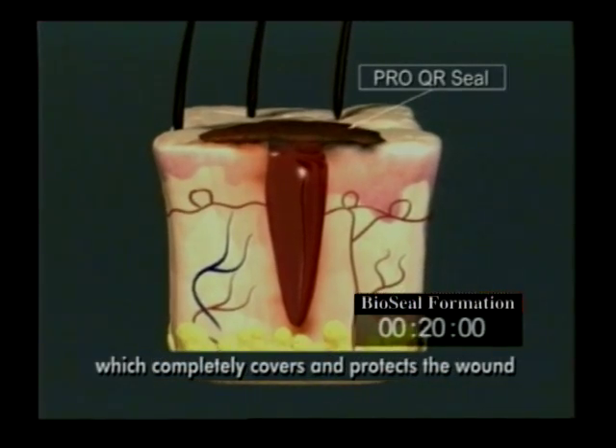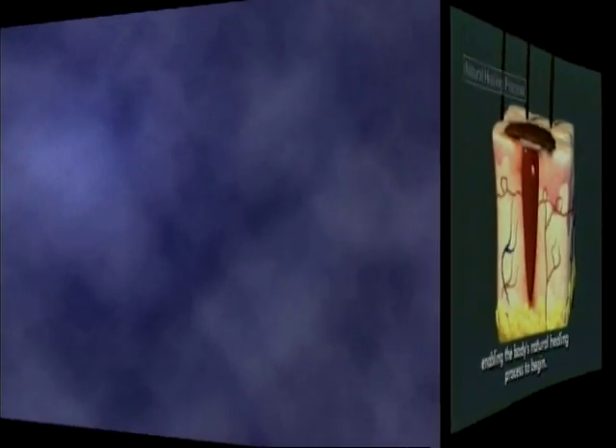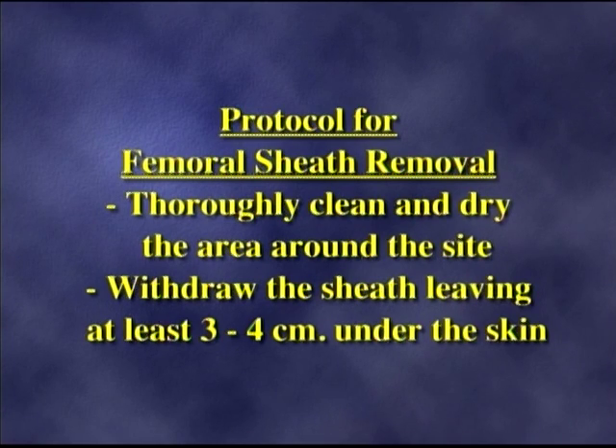Now let's take a look at how to use BioSeal Advanced. Thoroughly clean and dry the area around the site. Withdraw the sheath, leaving at least three to four centimeters under the skin.